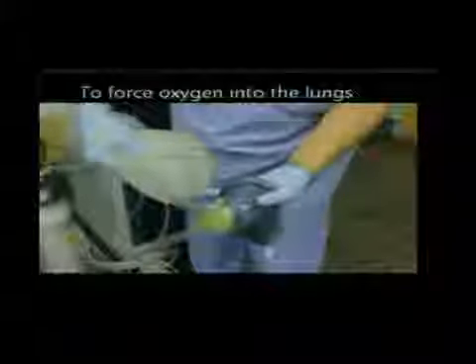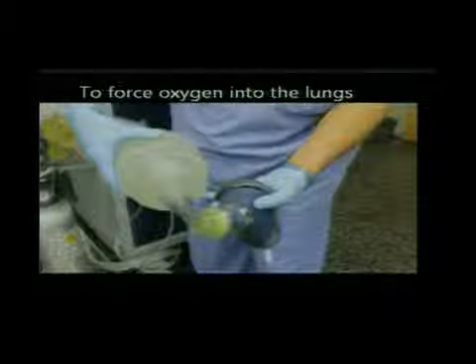And so you can see multiple approaches to the airway, multiple approaches to having oxygen available, and two different ways, the anesthesia circuit and the backup bag available in the operating room, so that you can force air into a patient who stops breathing. Please continue. And there he's verifying that he can force oxygen into the lungs with the resuscitation bag. Stop.